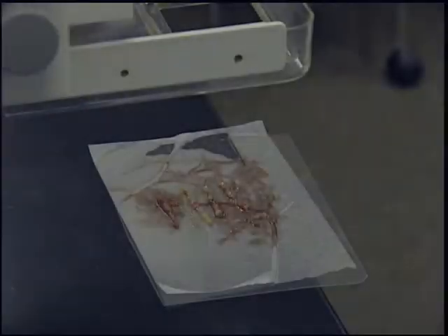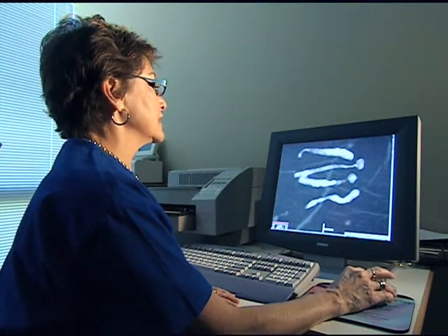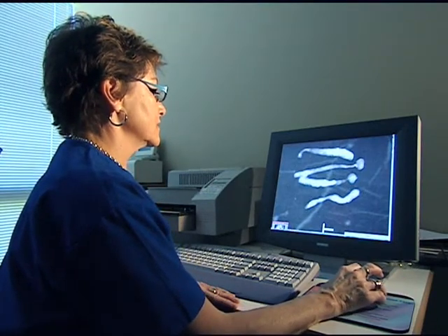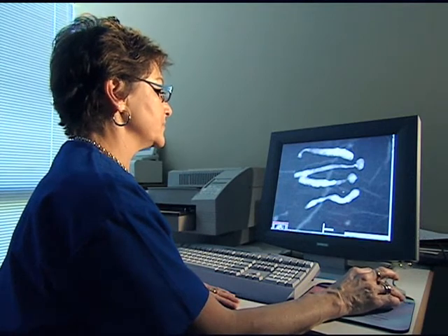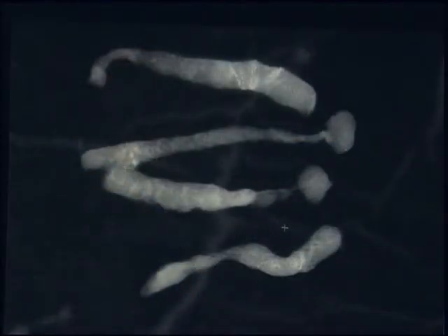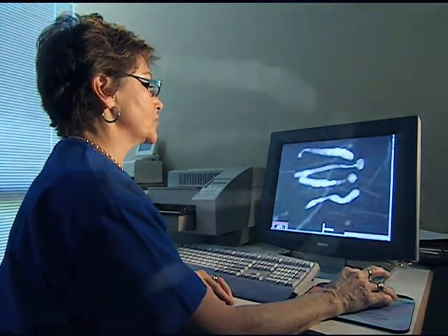I feel very good about the placement and the removal of the calcifications. The specimens are radiographed to verify micro calcifications are present. This is a good example of the specimen radiograph. We took four samples with the Vacora 10-gauge. Usually four is enough when you're right in the area that you want to be — we can see this was well sampled with some calcifications actually in each core.